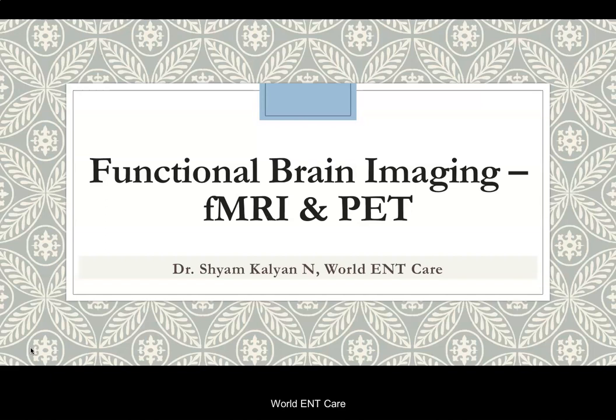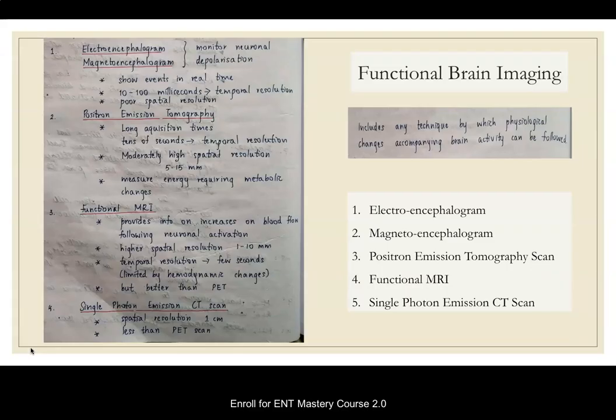Functional MRI, its principles and applications in ENT. Similarly, PET scans, the radiotracers, the principle and its applications in ENT. Next, in your DNB OSCE exam, frequently they keep reports or the pictures of functional MRI and PET scan and ask you to differentiate between these, identify which is which. And trust me guys, during exams, both these pictures look exactly similar.